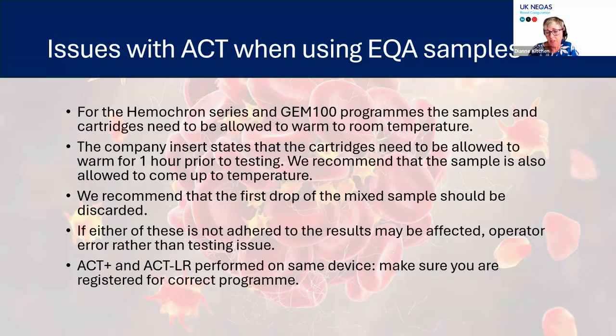And because I said that they can be the same device, just in different programs, you should make sure that you're registered for the correct program, because we have had users that have ongoing issues, and then when we investigate, they are using ACT plus cartridges, but they've registered for the LR program, so that's important.